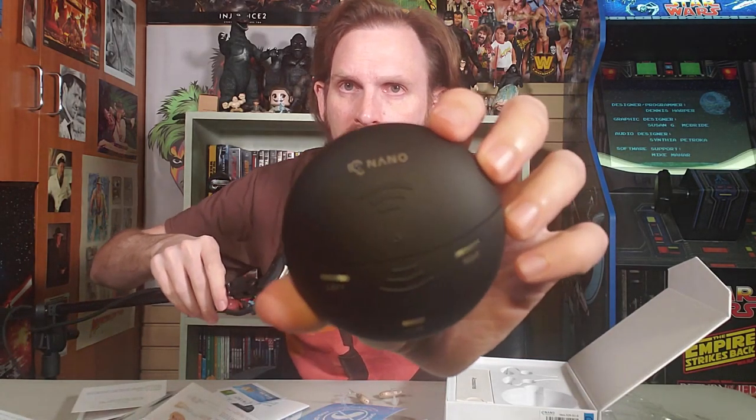Then we've got the case here — it's a nice looking case. It says Nano on it. And it says left, right, and then it says the case right there. We'll take a look at the case and I'll show you the hearing aids up close soon.